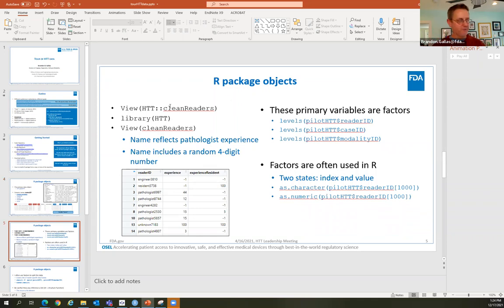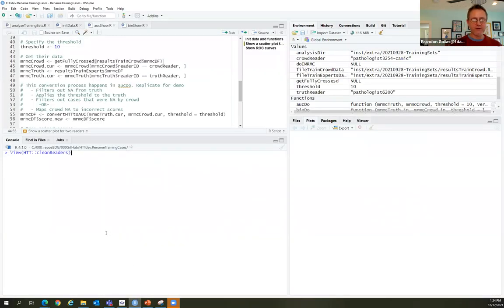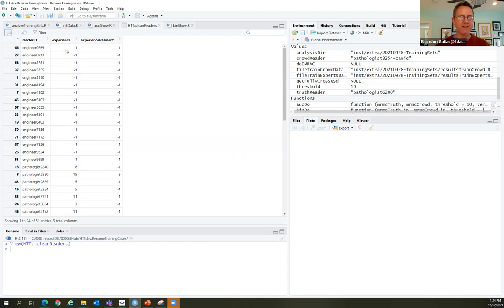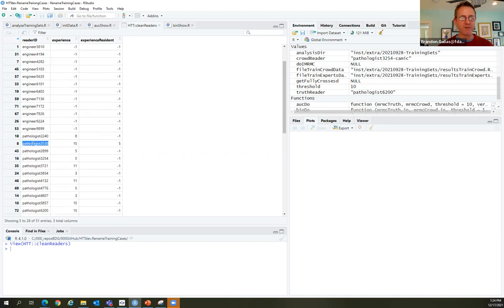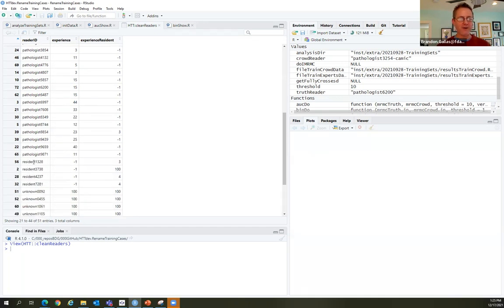Looking at the readers data frame using the view() function, you can see a column with all reader IDs and experience levels. When experience is negative one for both values, it's an engineer who was testing the platform, not a data collection participant. Pathologists have a number under experience representing years as a board-certified pathologist. We also have some residents with a few years of residency.